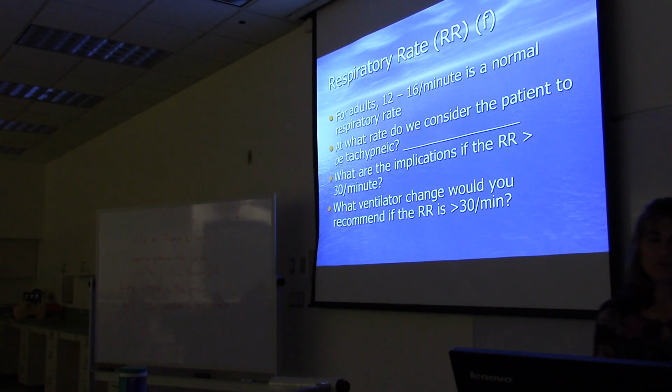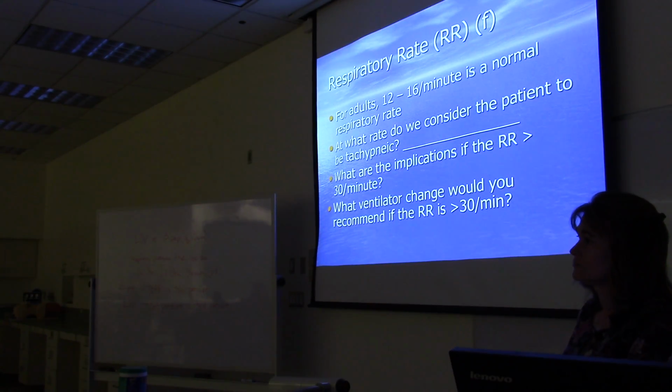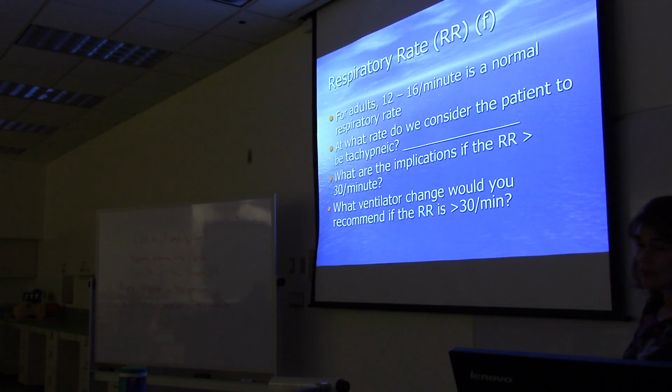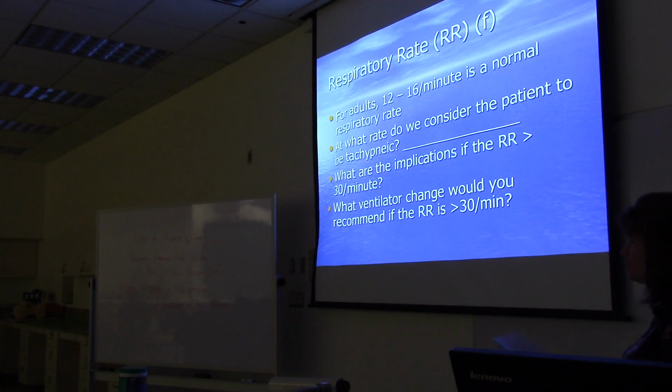What ventilator change would you recommend if the respiratory rate is greater than 30 breaths per minute? The answer is change to a full support mode to minimize work of breathing.